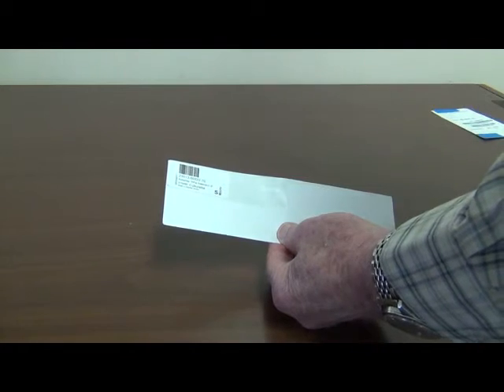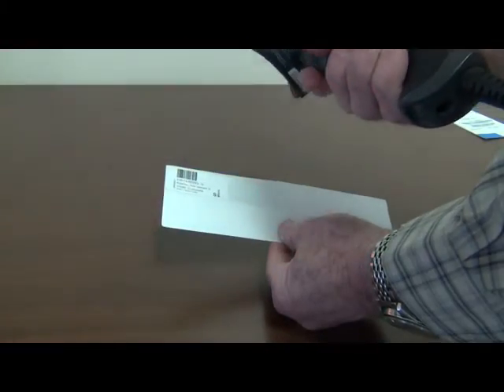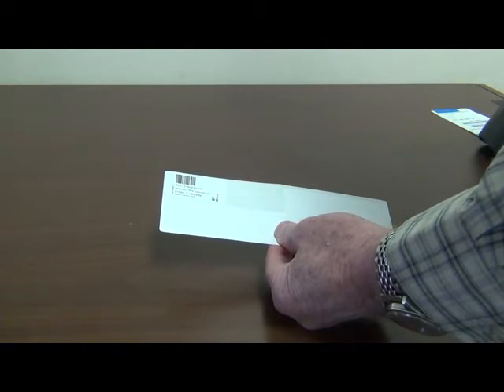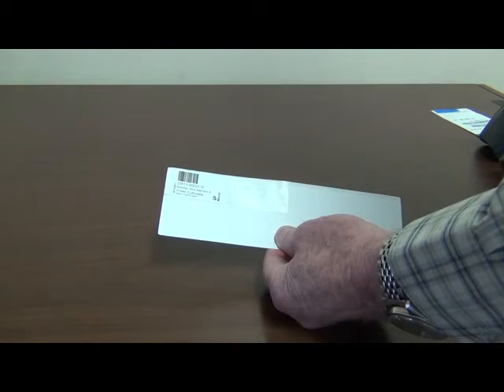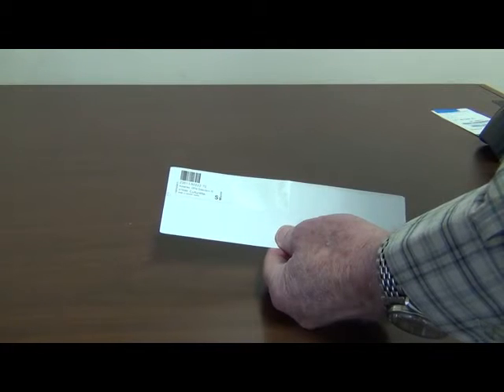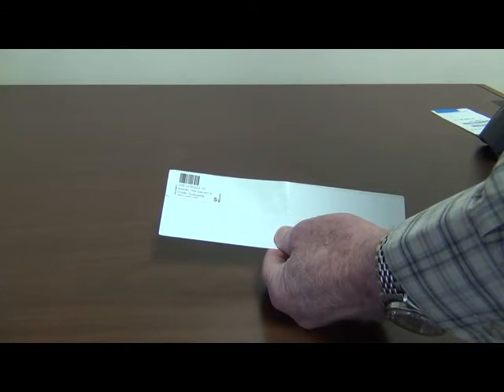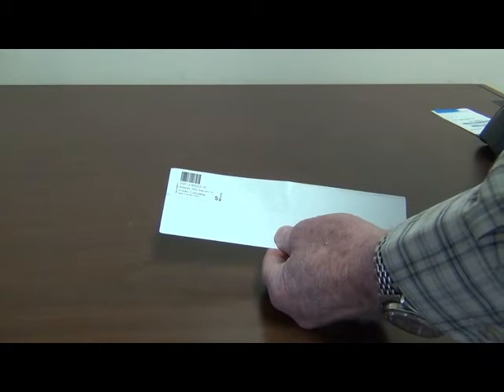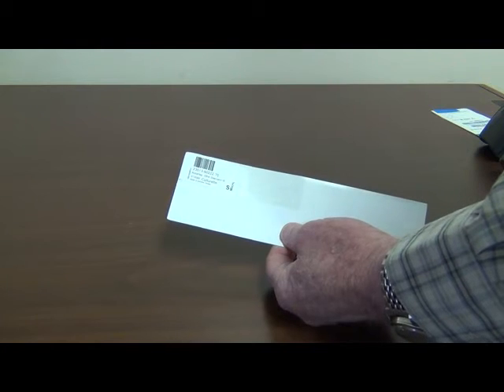But having said that, the other scanner that I was using can see it with difficulty. Some people might pass that by and say, well, it did scan with my barcode. And the reality is that when you have a barcode that's slow to scan or requires the operator to move around and check different angles, it's an indication that there is a problem with that barcode. And the majority of the problems in scanning are traced to barcodes, not the scanner.